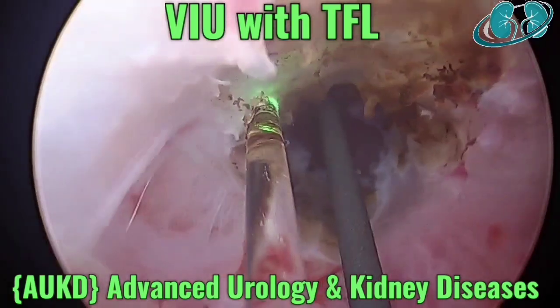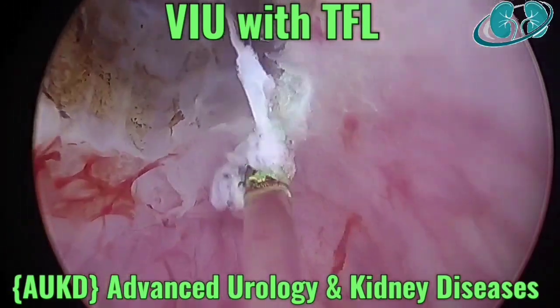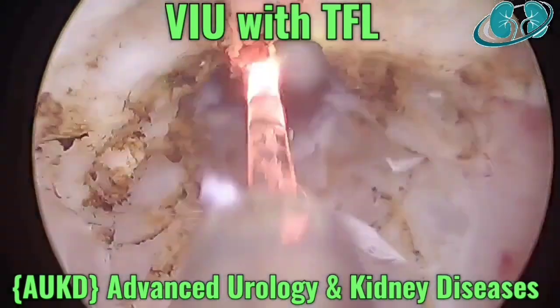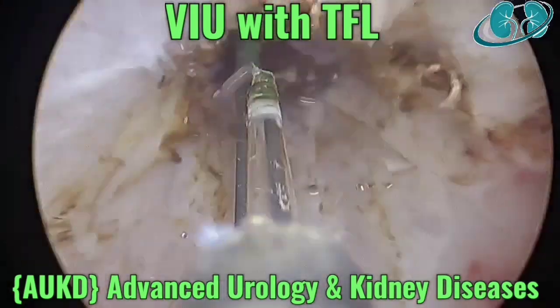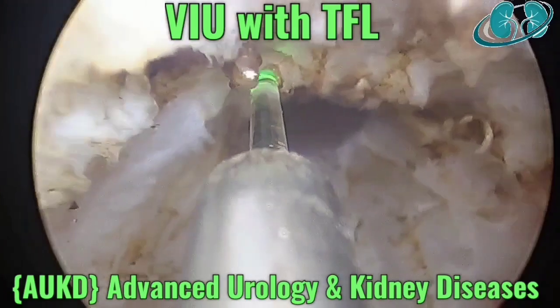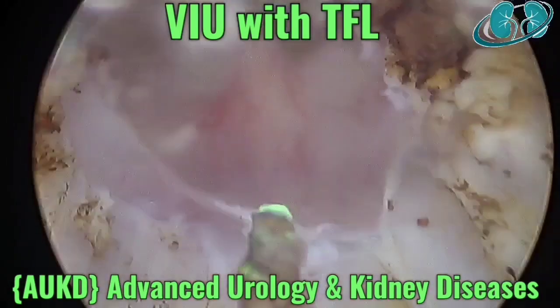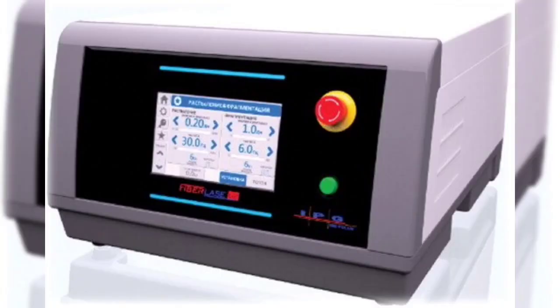You can see that the spongio fibrotic tissue — the fibrous tissue — is being evaporated with the fiber laser in the same sitting. That is the main reason that the recurrence should come down, because in most cases the recurrence is due to persistence of the spongio fibrotic tissue, which is seen with optical urethrotomy using a cold knife in the conventional method. As you can see, the spongio fibrotic tissue is completely removed all around, and technically that should lead to a decrease in the recurrence rate of stricture urethra when done with Thulium fiber laser.